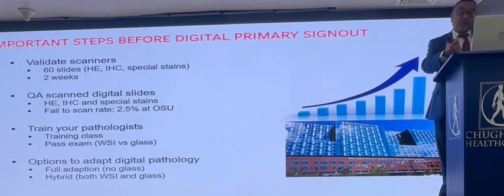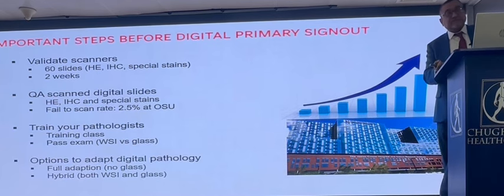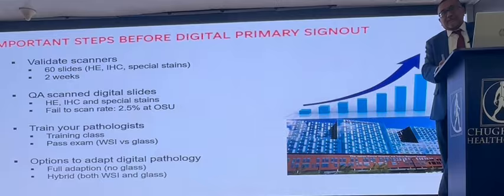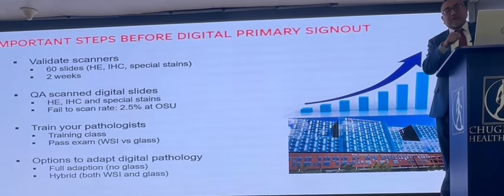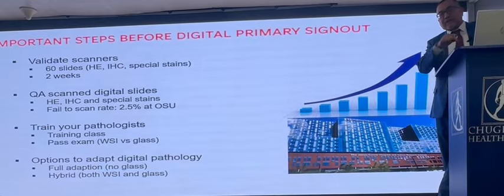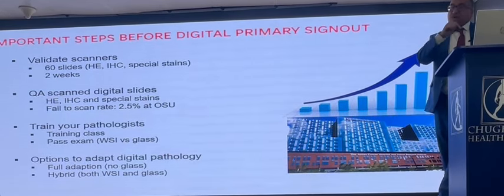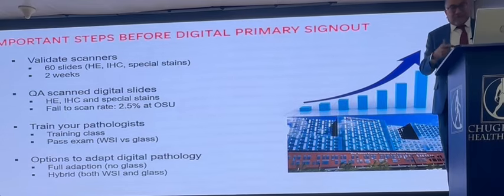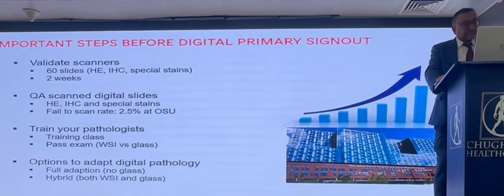And then in my institute, we don't force anyone to sign out digitally. We still have pathologists who don't want to sign out digitally. But out of 100 pathologists, 40 are anatomical pathologists, and 39 of them are digital. So if the system goes down, I get a lot of angry emails. Fortunately, not me personally, but the IT department.